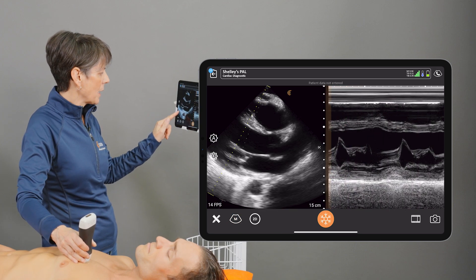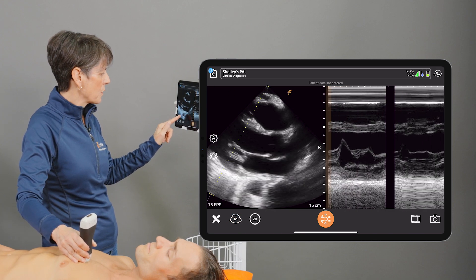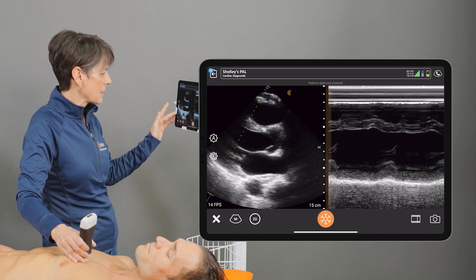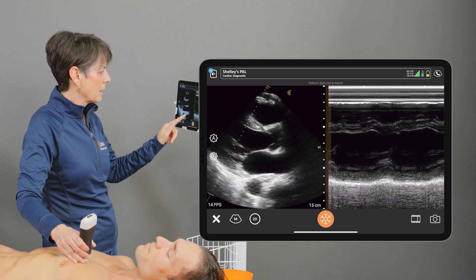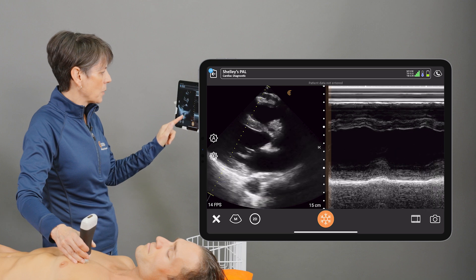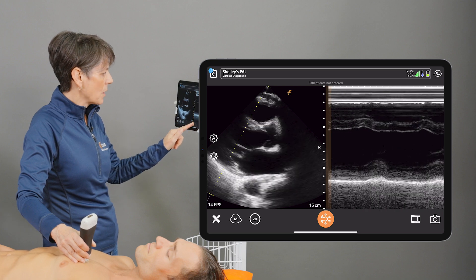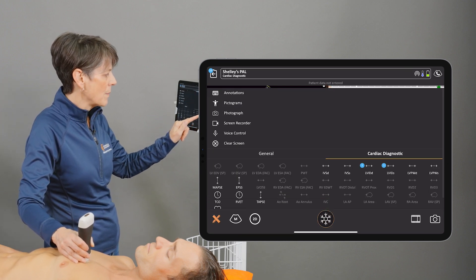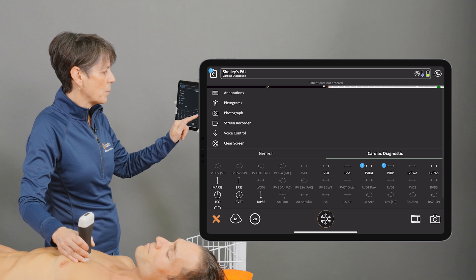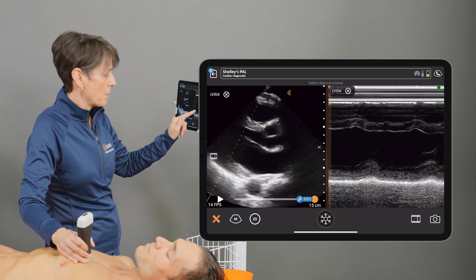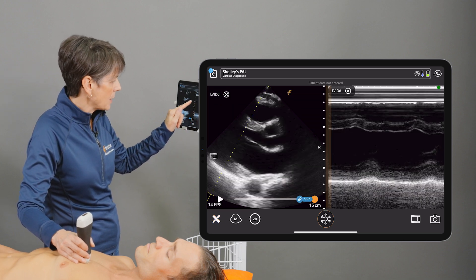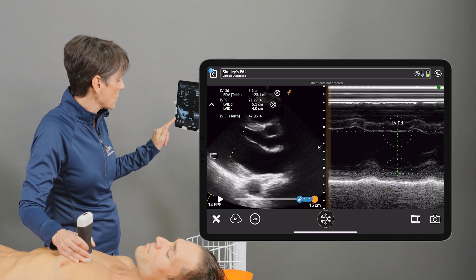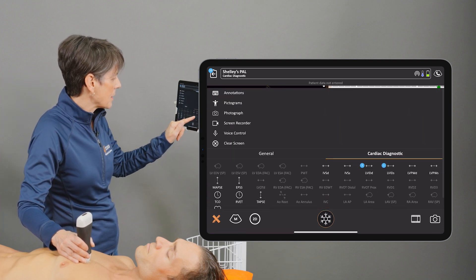I'm going to place the M line just over those walls distal to the mitral valve leaflets, and when we have an image on the M mode I'm going to freeze it. We can go into the calculation package and we'll measure the left ventricular inner diameter in diastole as well as in systole.